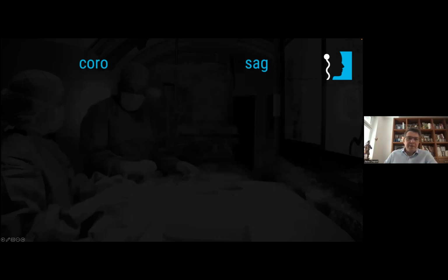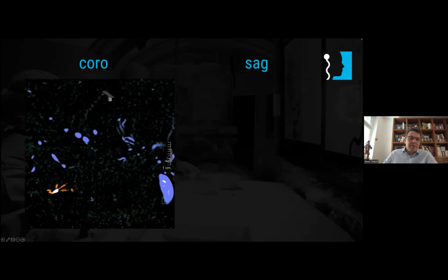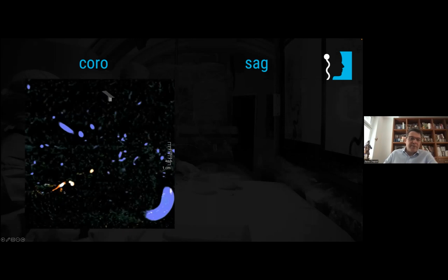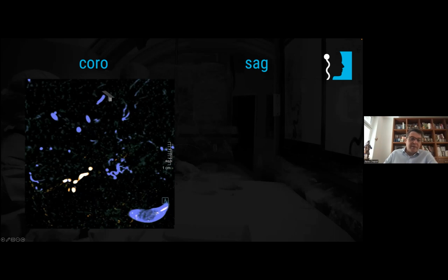And on this image, you see the microcatheter in orange, and the whole rest in blue. So orange is the injection through the microcatheter, and you scroll progressively through all pictures. So there are a lot of pictures to look at. Somewhere is a junction between artery and vein, but here you see something interesting. Here you see that what you get from a microcatheter is not the whole AVM. There's another part of the AVM which is coming from somewhere else.